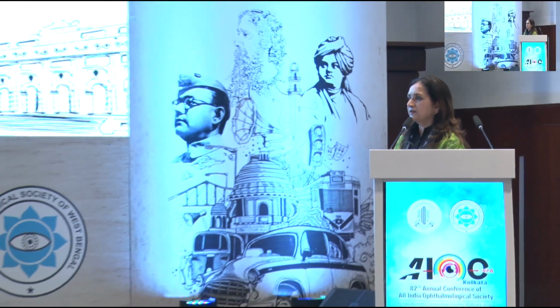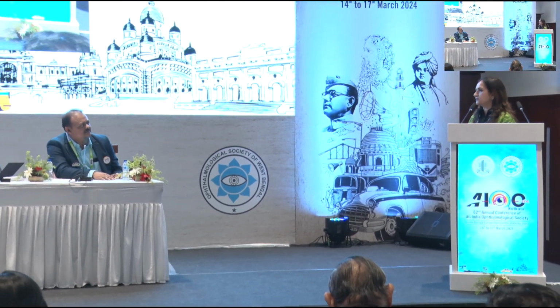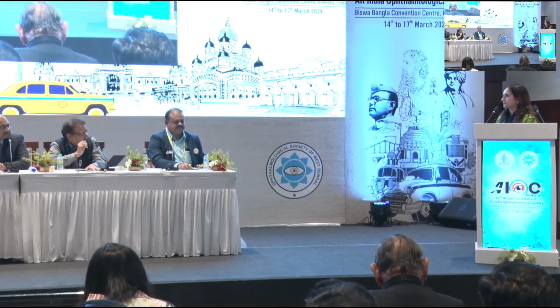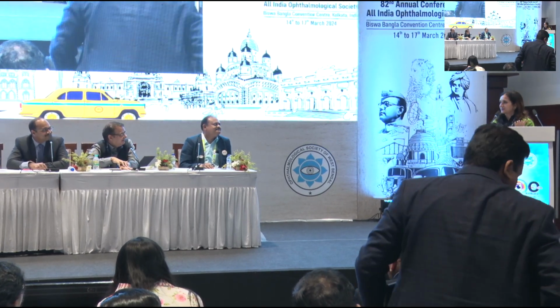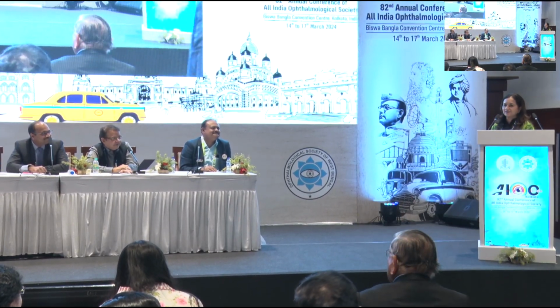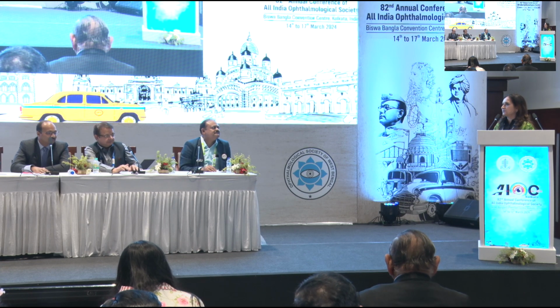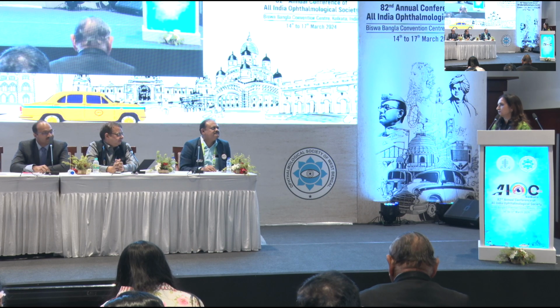So do you prefer to give an anti-VEGF at the end of the surgery? Yes, you can do that. Anti-VEGF at the end of surgery, a lot of us use. It can be done. It's very useful. Have you tried glue when it's intractable bleeding? Dr. Malika is here. She has described use of glue for these things. Even Dr. Tyagi is using it. So there are other things which can be used, but I have not used glue till now.